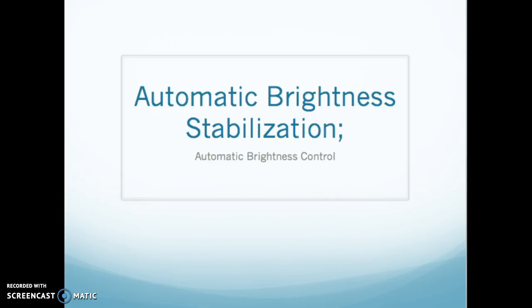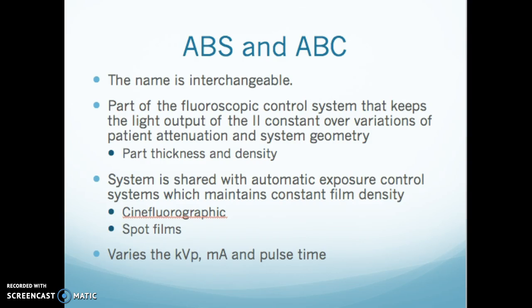Okay, so the automatic brightness stabilization. Here's your video on that. So the automatic brightness stabilization and the automatic brightness control is interchangeable. So you'll hear on the newer systems we use the ABS instead of the ABC.